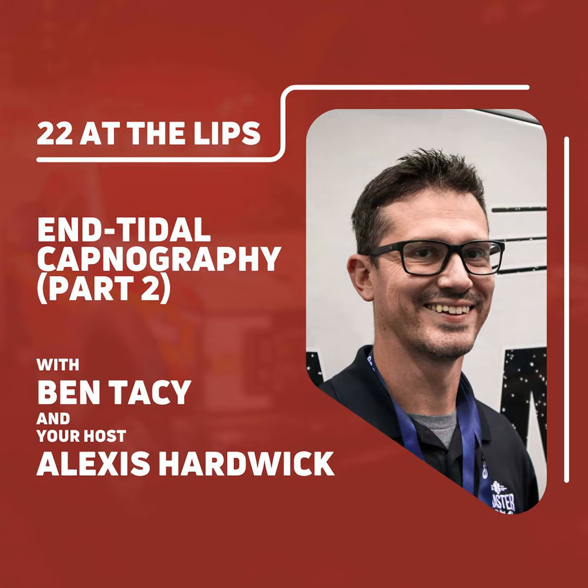There's a large pocket of generally 100% oxygen in there, and your quantitative measurement is going to be a little bit low. But again, we're looking for that trend, looking at the numbers increasing up to within a normal range and improvement in the qualitative measurements of that plateau or reducing the shark fin and so on.